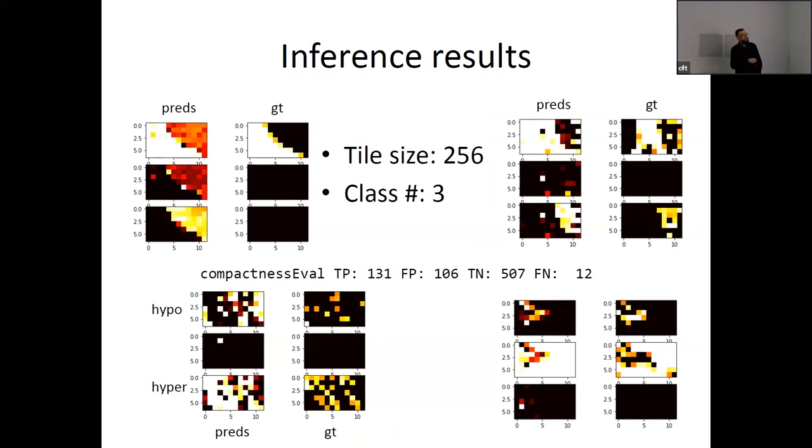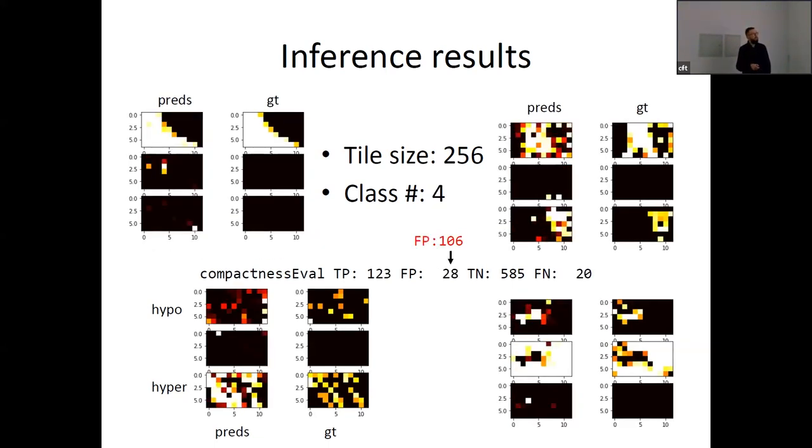And here we had the deep learning approach, of course, but we didn't like the prediction of, for example, here and here. We have the ground truth that is the first class, and this is not established in any of these classes. And so we increased the number of classes to four, and the fourth class was like the trash class, any other thing apart from these architectures was put in the fourth class. And this provided better results for the predictions. This is more similar to the ground truth. As you can see, the number of false positives dropped significantly.